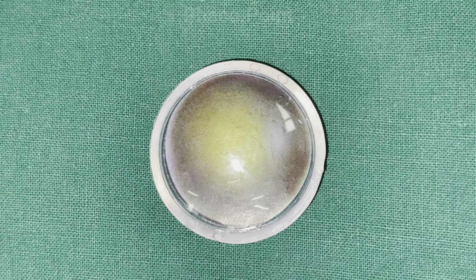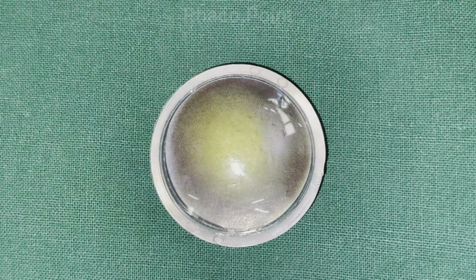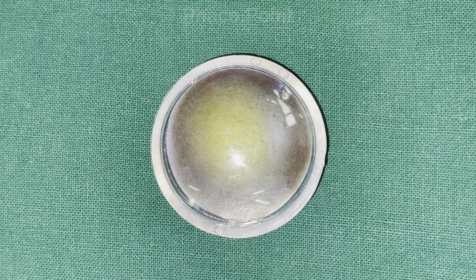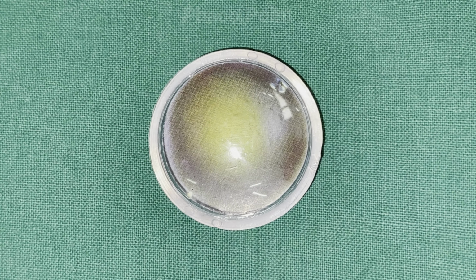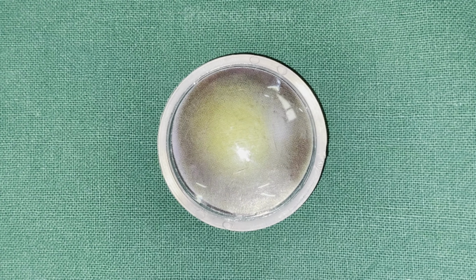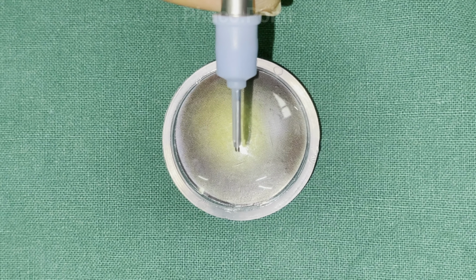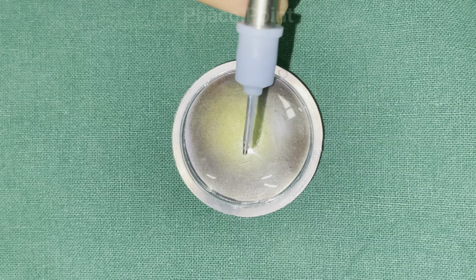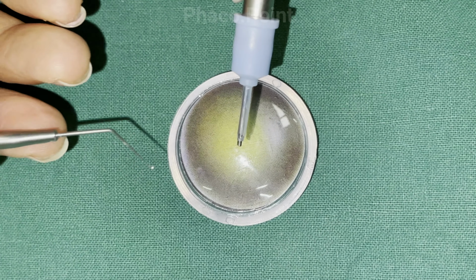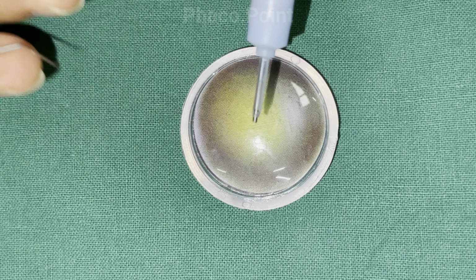Now let's understand the principles of direct chop on a model eye. The preliminary steps, that is your incision, your capsular access and your hydrodissection, remain absolutely the same. Make sure that your phaco probe and tip are optimal, you've got adequate exposure, the tip is not damaged in any way, and your second instrument is a chopper of the adequate length and sharpness that you desire for that case.